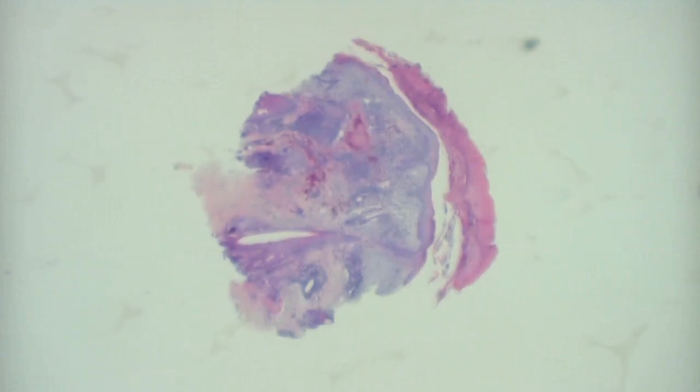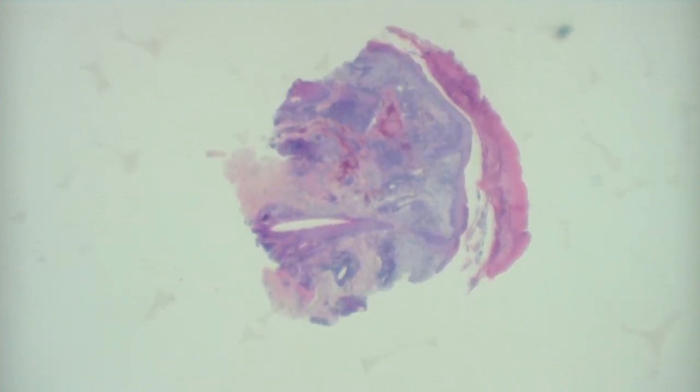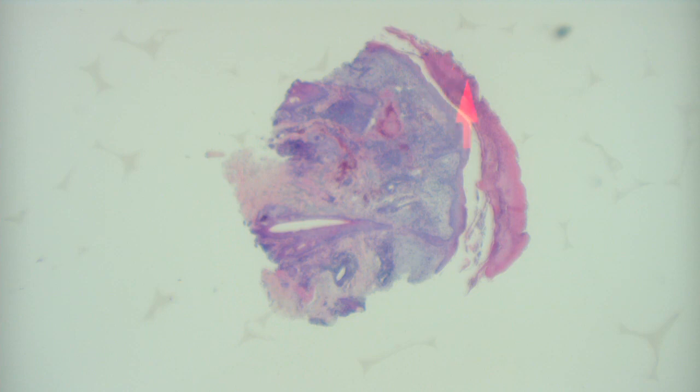What part of the body do you think this might be from? Large hair follicle, maybe scalp. It's not really deeply rooted in the fat, though, is it? There's a couple of little sebaceous glands here, and they're not giant. So maybe just the face. Yeah, face. And it's a pretty dense inflammatory infiltrate, with a lot of scale crust on the surface.